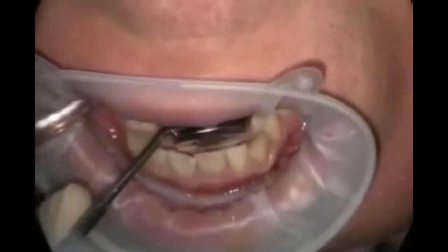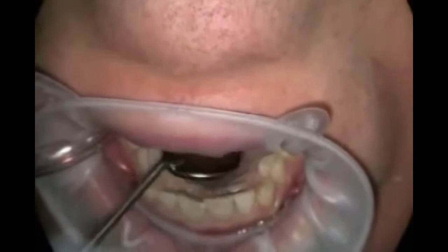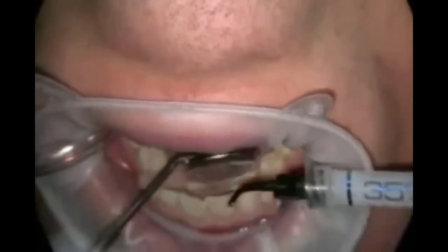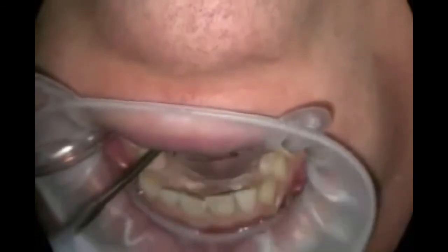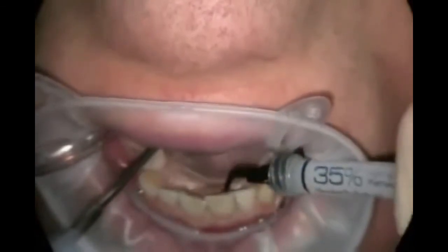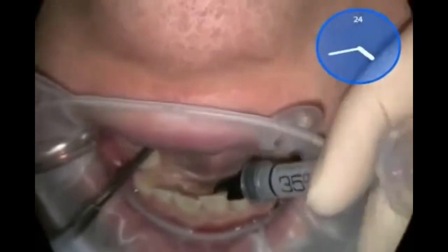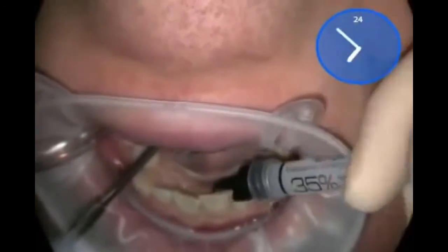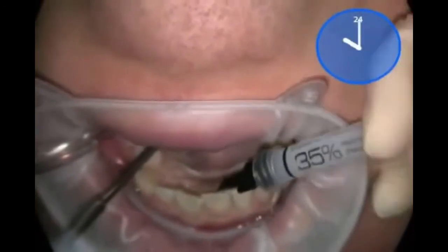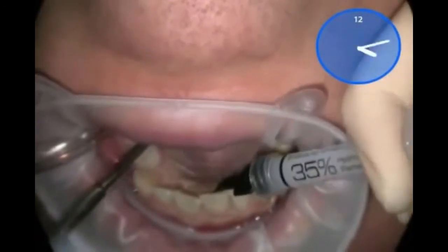Bleaching gel is inserted in the cavity that is subsequently created. The tooth is then tightly closed, and the gel is left in it for two or three days. Depending on the discoloration, this procedure may be repeated several times.